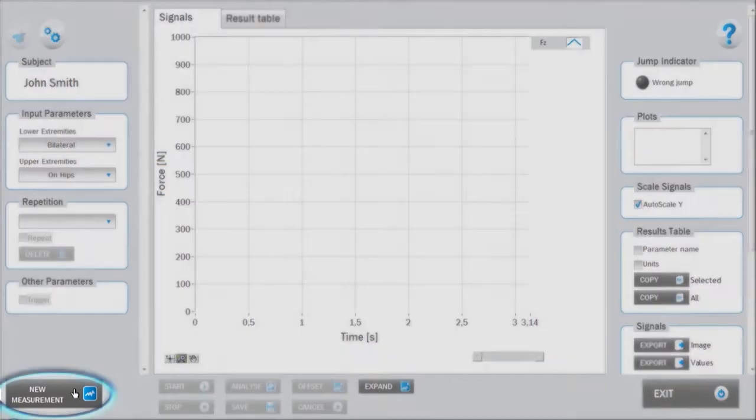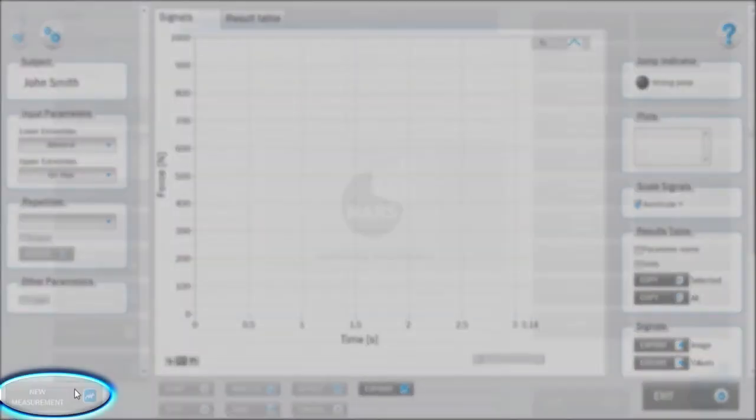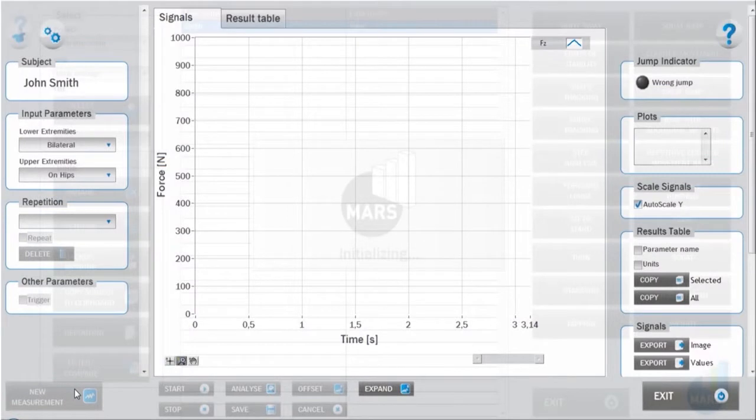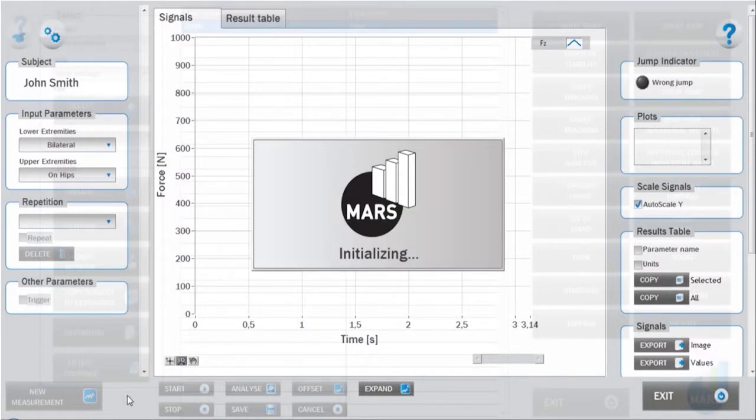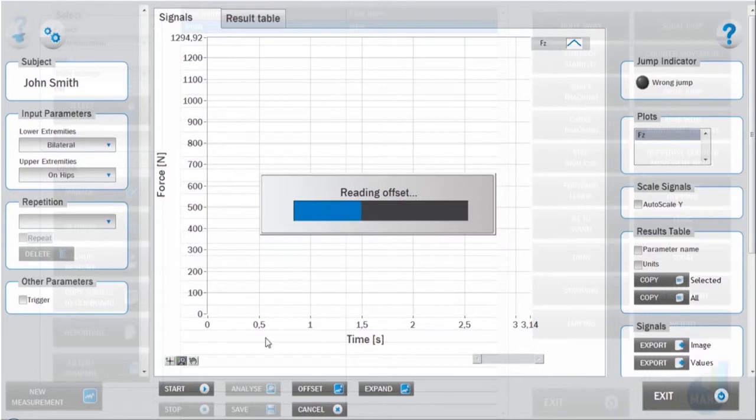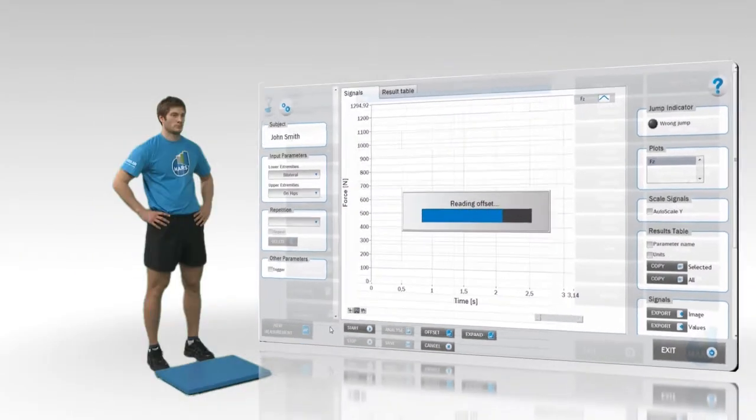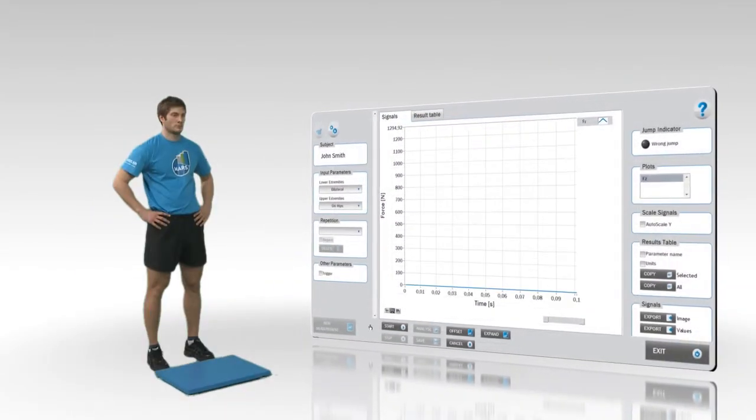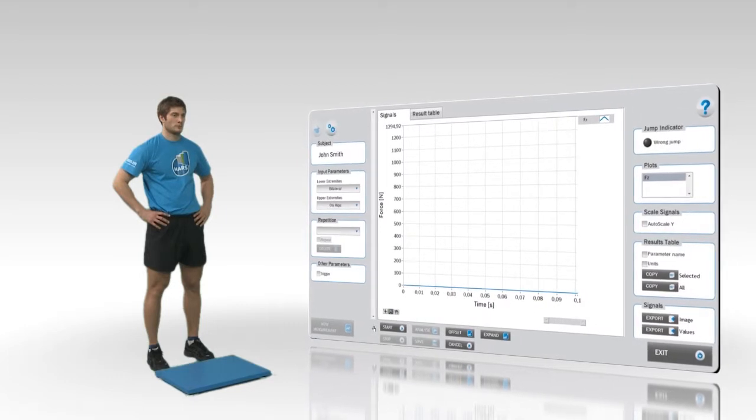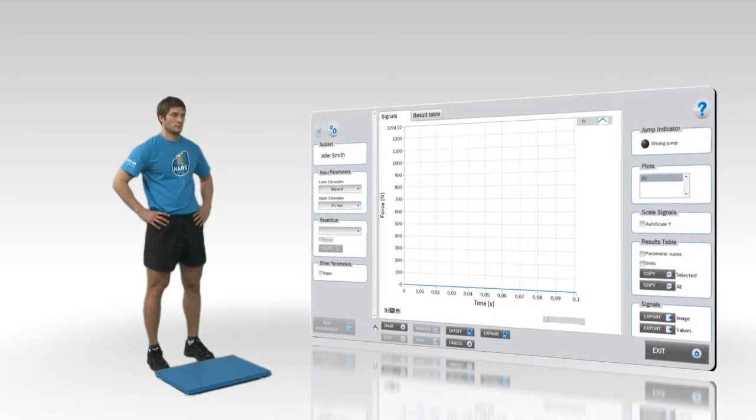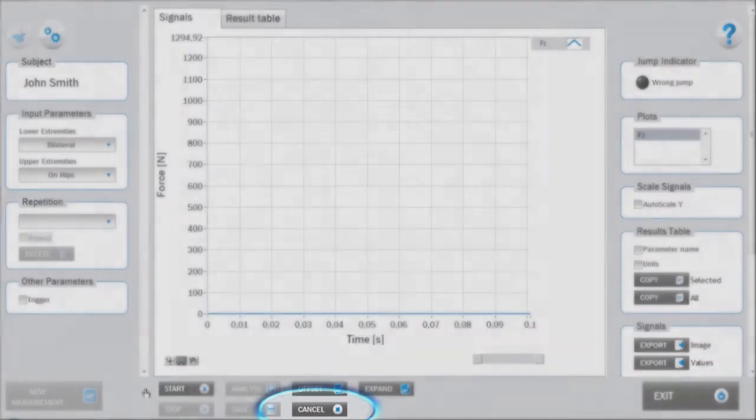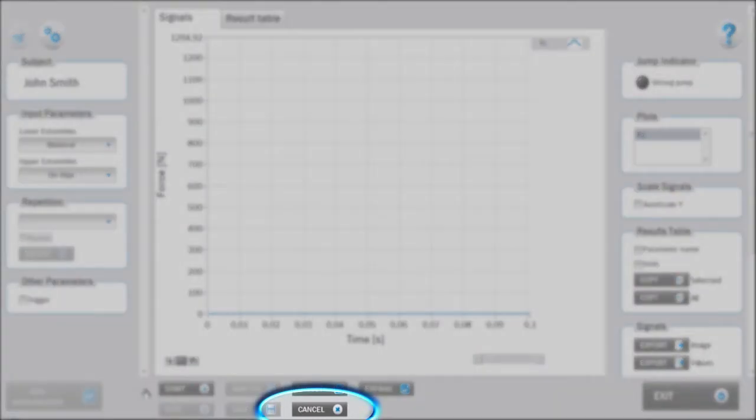To start with a measurement, click on the new measurement button. After launching the test module and clicking new measurement, initialization and offset takes place. During this time, the subject should not be on the force plate. If necessary, the measurement mode can be cancelled by pressing the cancel button.